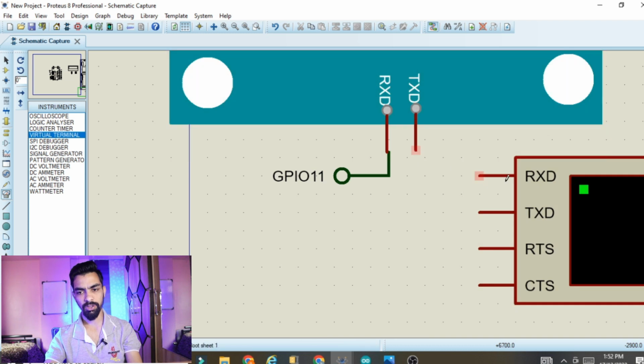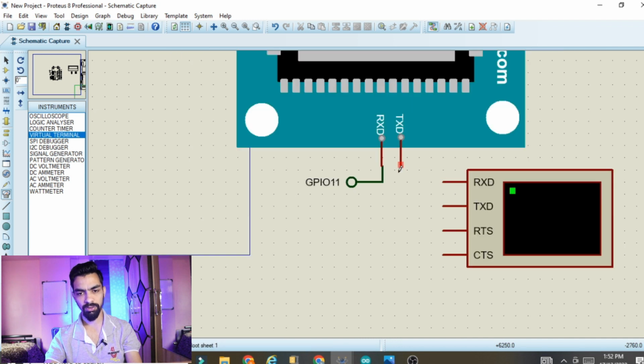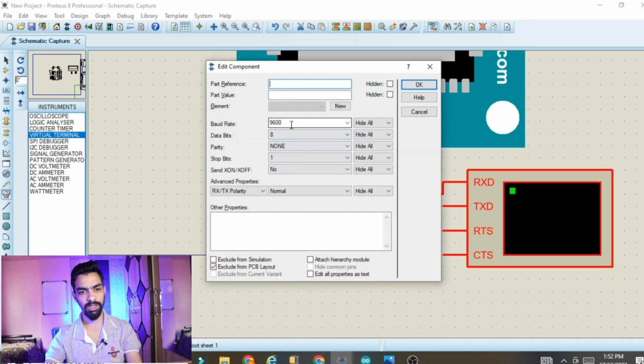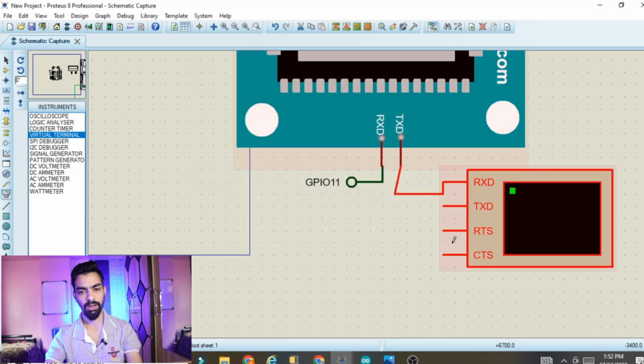Then the TXD pin of the GSM should be connected to the RxD pin of the virtual terminal. So connect the pin like this. Like this we have connected. Double click on this virtual terminal, make sure your baud rate is 9600 and click on OK.